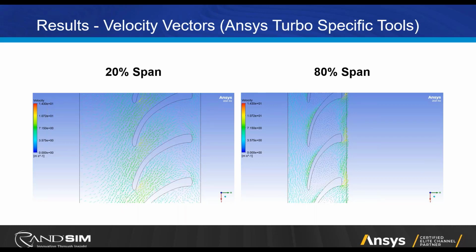Overall, it looks okay, although the flow's coming back a little bit at the trailing edge here, which is not ideal either. So yeah, these are areas that we can certainly improve on, but these are things you want to be able to see. And it's a little difficult to see this in a traditional 3D view. And the other thing I'll mention here is 20% span. What that means is you're down near the hub. So 0% span is the hub, 100% span is the shroud. So we're looking at basically a surface of revolution like I showed earlier, but imagine it just being unwrapped and laid out so you can see it in 2D.